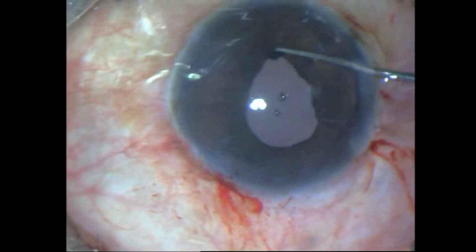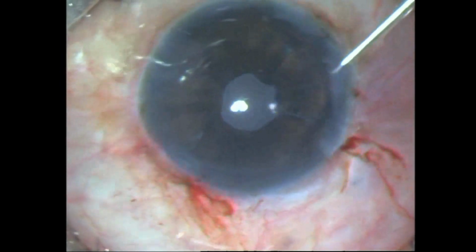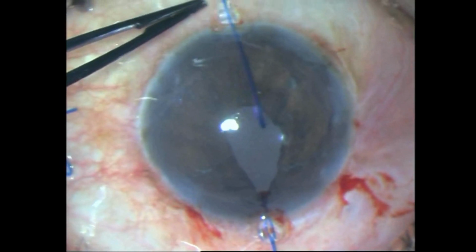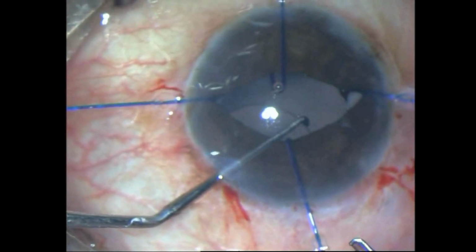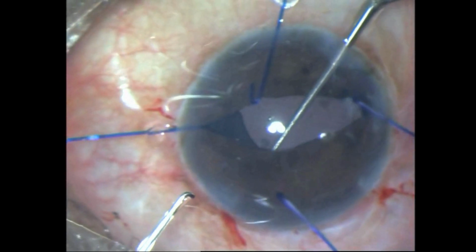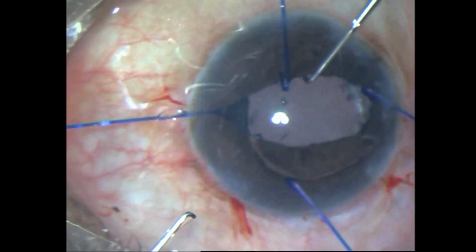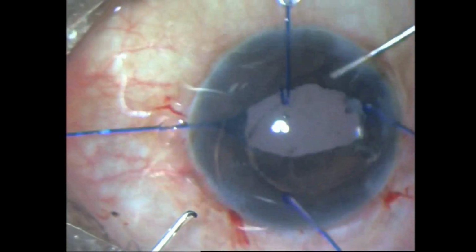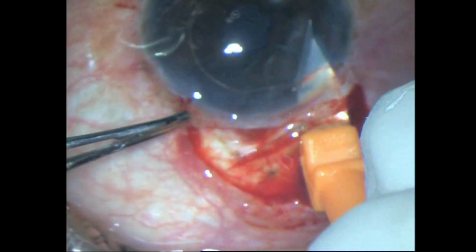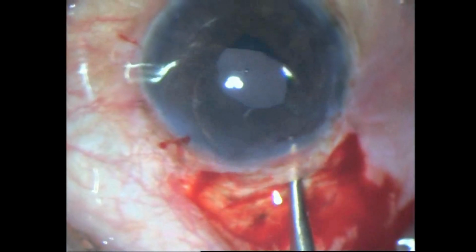So it was back to the drawing board again, put in some OVD, and my good old iris hooks came to my rescue again. Again dislocated the IOL into the anterior chamber, and this time I had to go to plan B, that was putting in an iris clip lens. And this time I didn't go from the temporal side. I again very carefully dissected a tunnel superiorly, brought out this lens, mind you, all the time I have kept the hyaloid face intact. There is no breach of the hyaloid face.